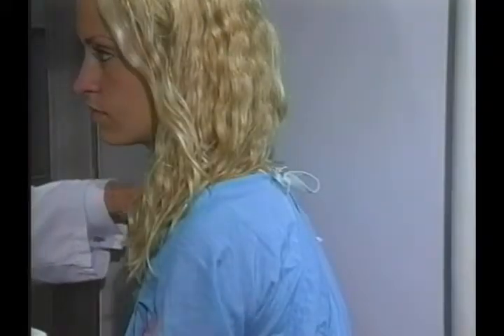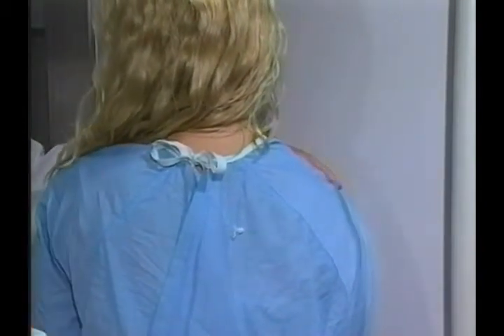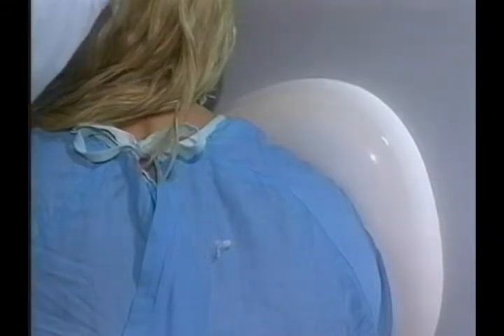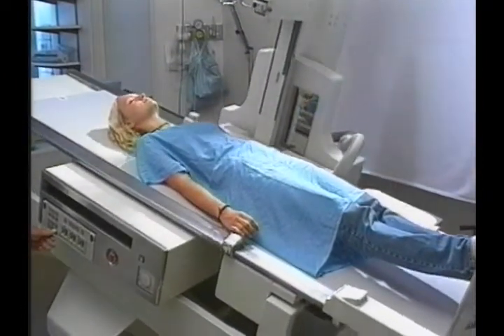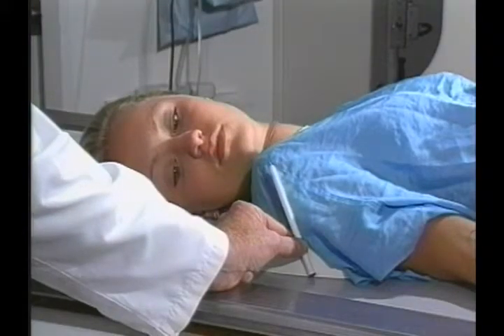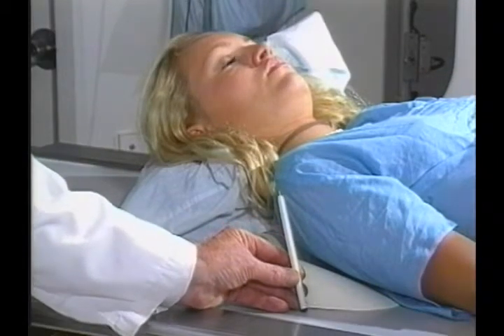The second view for trauma is the axial of the shoulder blade. Here the boomerang helps a little, but is not always sufficient, especially with tomography. Adding a bag of saline helps, and even mixed with iodine. Lying down, the shoulder reverses backward, and thus we must increase the angles used upright to some 25 degrees normally, and about 5 degrees only for a kyphosis.